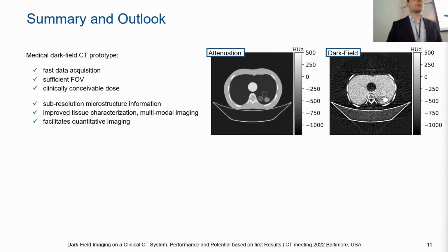These are remaining artifacts that stem from the movement of our object, which we try to mitigate with a newer processing approach, but there are still some remaining. This is something where I imagine we could benefit from iterative reconstruction techniques, because then we could include the movement of our object in the forward model.